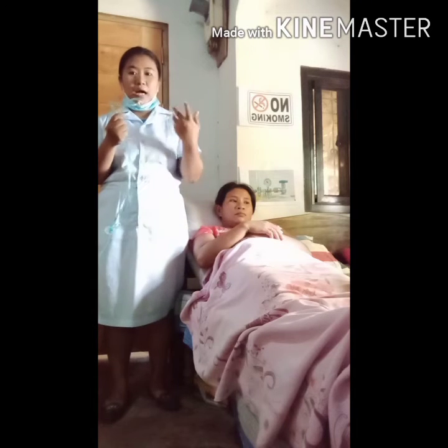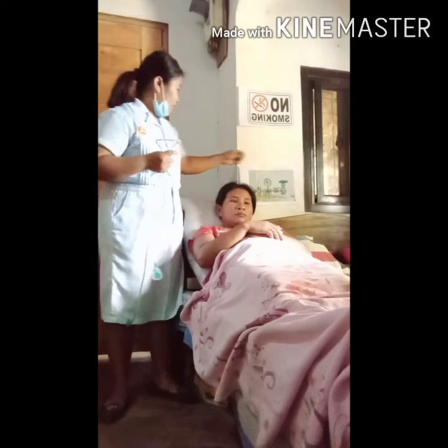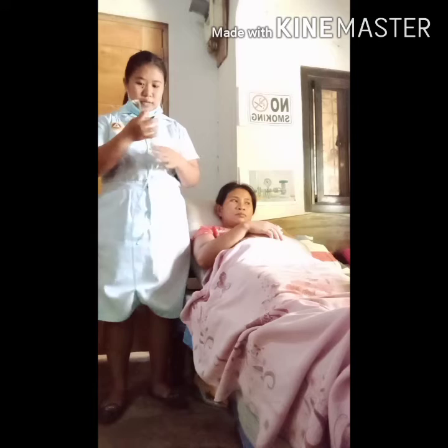Next is attach the oxygen tubing to the humidifier, and then next is turn on the oxygen at the prescribed rate. And then next is check that the oxygen is flowing through the tubing.